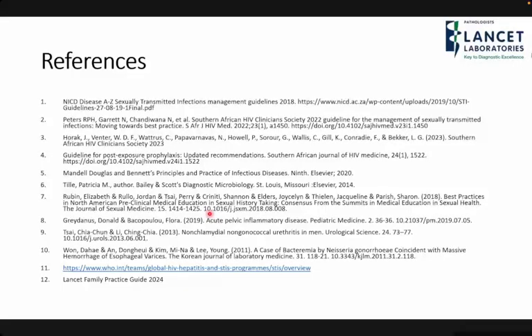And then point of care testing. We don't do point of care testing, but I know it is available. NHLS does do, I think they have the syphilis and the HIV testing. The main reason we don't do point of care testing is because of quality assurance, quality control. Even in the point of care, the problem has always been quality, and we're not able to assure good quality with these tests.